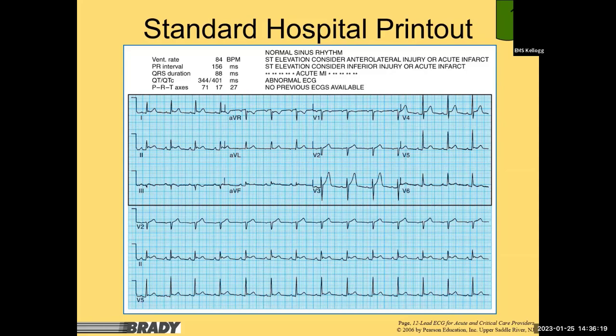There's a lot of numerical data on the printout. Ventricular rate: 84 beats per minute. PR interval: no more counting small boxes — it says 156 milliseconds, which equals 0.156 seconds. We're used to working with the range 0.12 to 0.20 seconds, so 120 milliseconds to 200 milliseconds. Is 156 ms within normal range? Yes. That's the conversion between milliseconds and seconds.